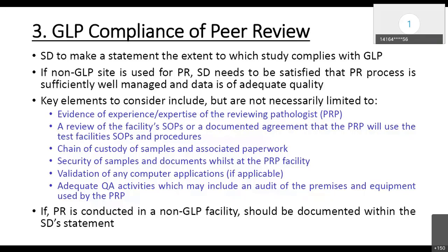So you need to generate a documented agreement that peer review pathologists will use the procedure which is established by the test facility. And the study director also needs to ensure the chain of custody of the samples and associated paperwork, security of samples and documents while at the peer review pathologist facility.